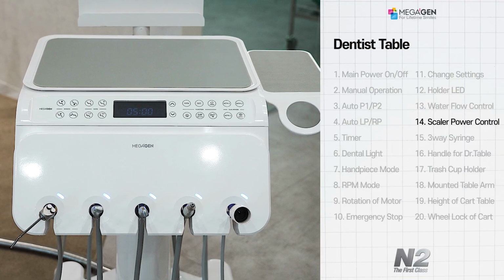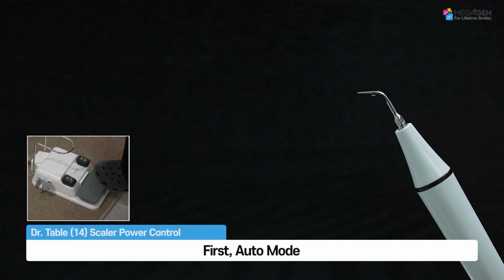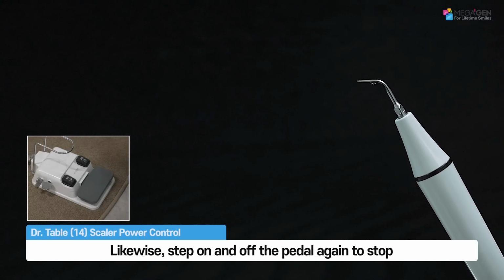Scaler operation and power adjustment. The scaler can operate in 2 modes, auto and manual. First, auto mode. Step on and off the pedal once to activate the scaler. Likewise, step on and off the pedal again to stop.